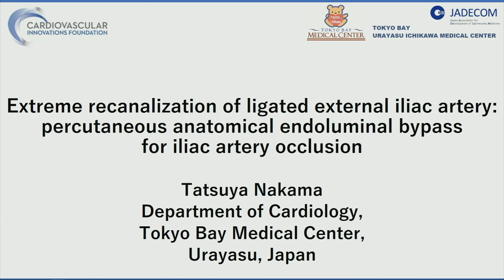Definitely a courageous and very good case with good outcomes. Any problems with the vein? Usually the veins are much bigger and they can accommodate the Viabahn, but you did not have any problems with the outflow of the vein? Actually, according to the follow-up CT angiogram, unfortunately, the iliac vein was occluded. Oh, it was? Of course, as you know, there are many collaterals in the body, so they're not a problem.